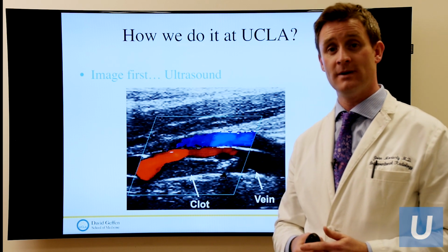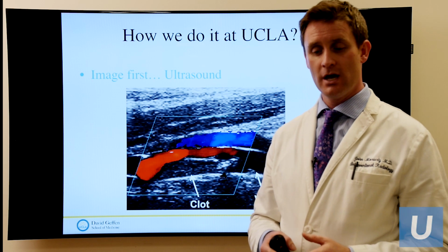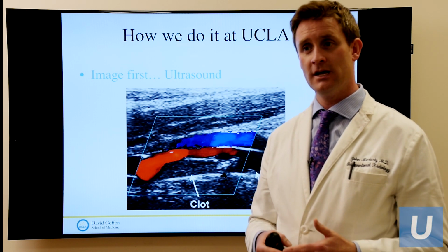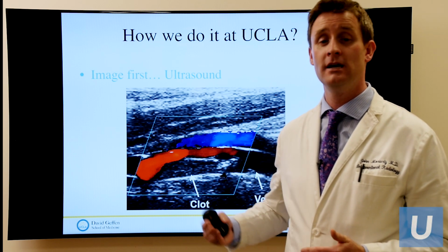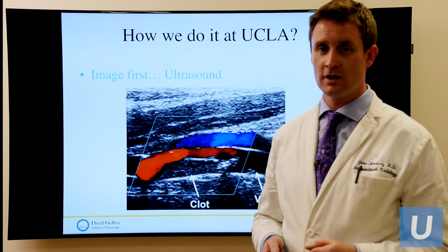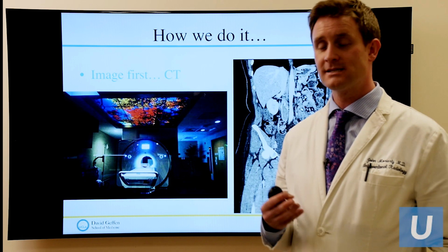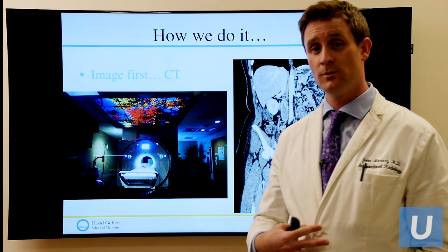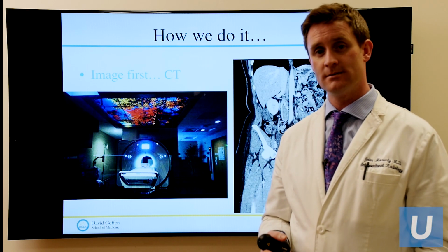And we're lucky to have some excellent radiology faculty here who are dedicated to this. We start off with an ultrasound, which is a painless test available widely in the community. It'll show us the clots very well, typically from the hip on down to the toes. Excellent imaging of clots, such as you can see here on the screen. The next thing we would do is evaluate where else is the clot. For example, is it within the belly? Is it within the chest? And there are a couple of ways we can do that.